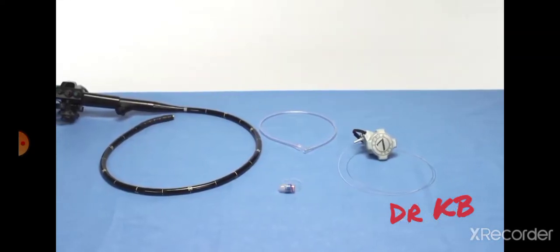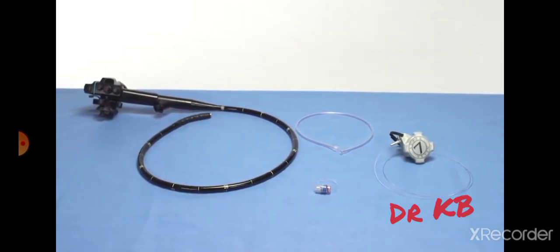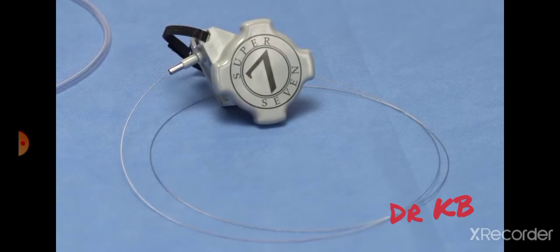Upon opening the package of the Speedband SuperView Super 7 device, you will find two components: the ligating unit and the handle unit with tripwire and scope fastener.